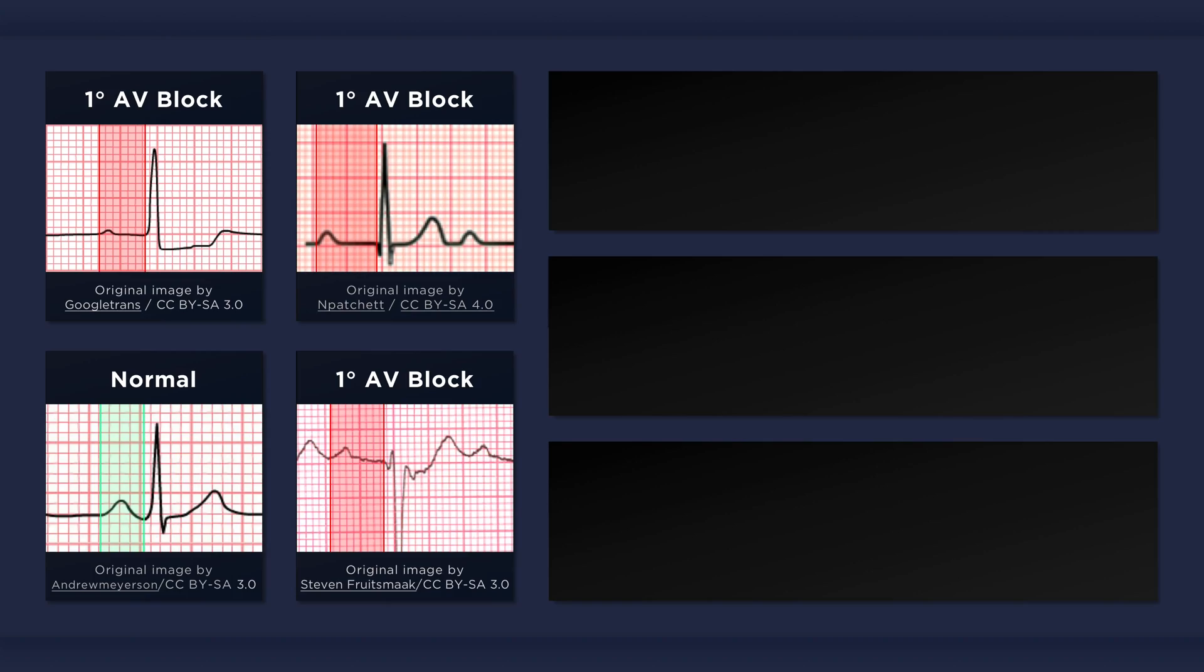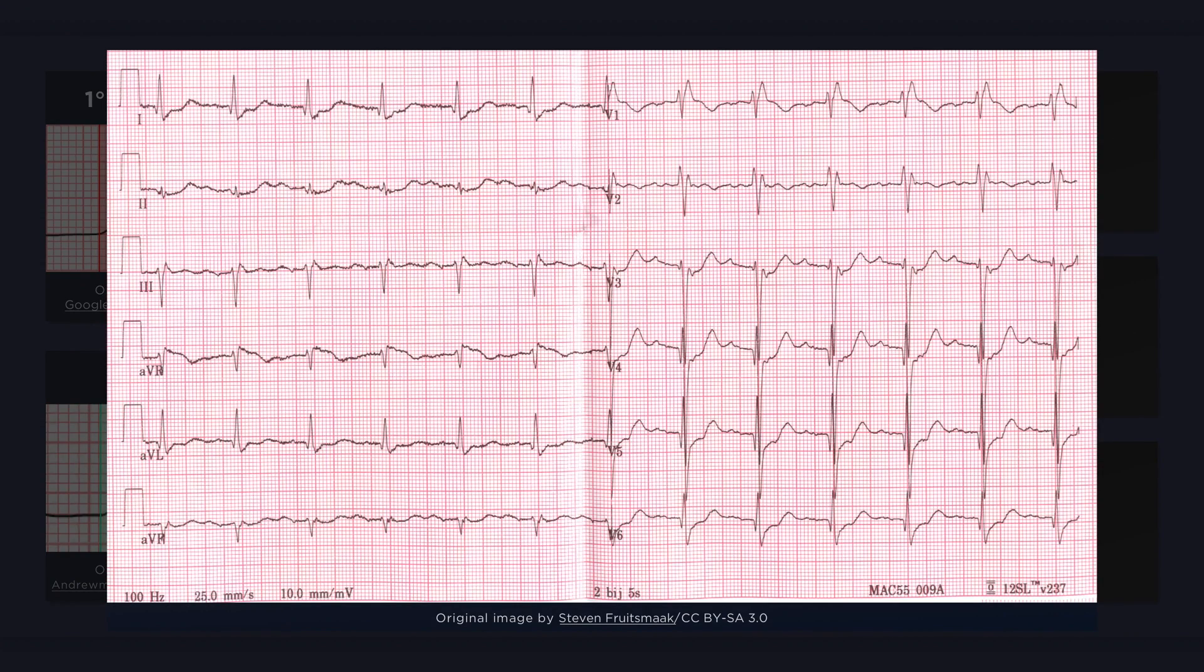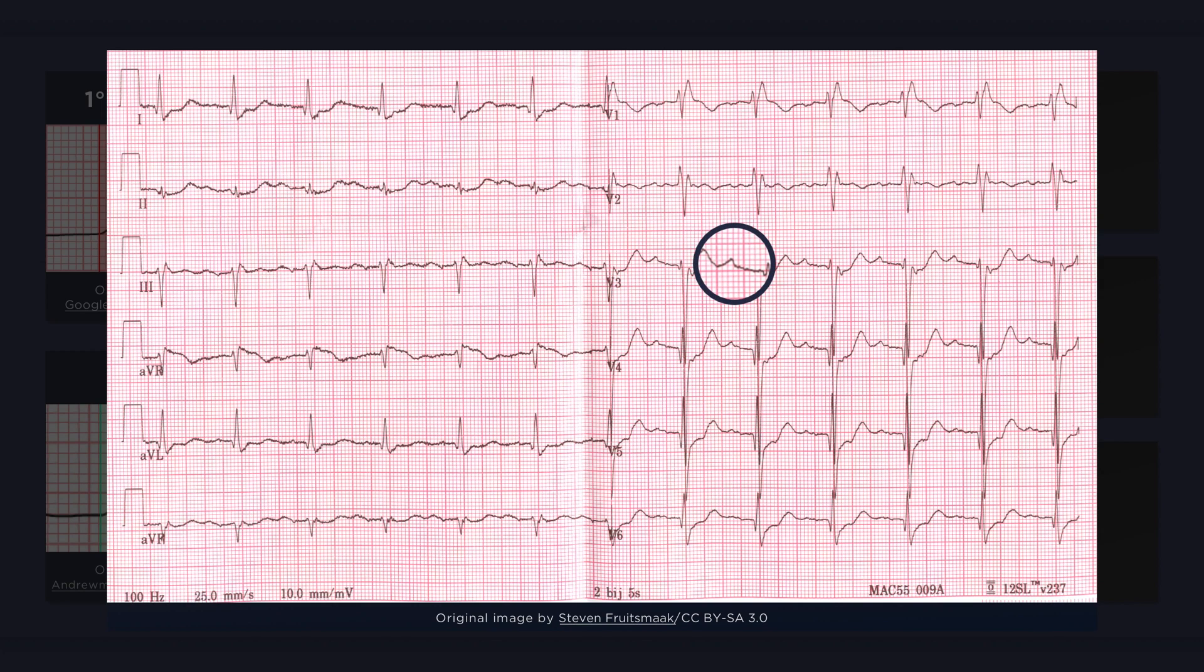Now let's briefly take a look at this entire ECG. What I would like to note here is that oftentimes there will be other coinciding findings, and the start of the P wave may be more difficult to discern. In this ECG, the P wave in the limb leads is a bit more flattened than in the precordial leads. Now it is clearly visible in V3.